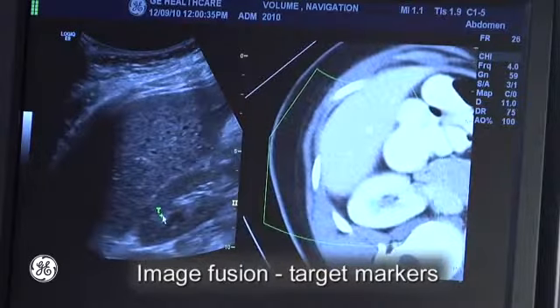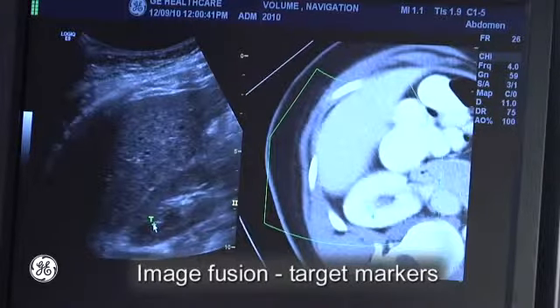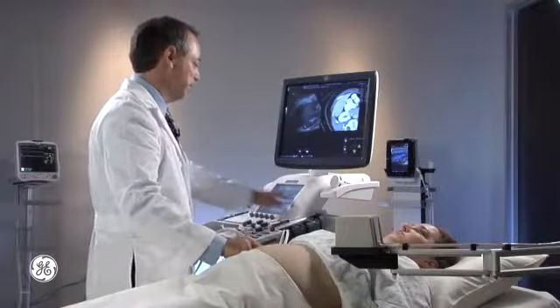If I was following the advancement of a needle, for example, I can now say I see it maybe further along, so it's going to take that same target and move it for me as I move my arrow. So that's one example of GPS markers using target.